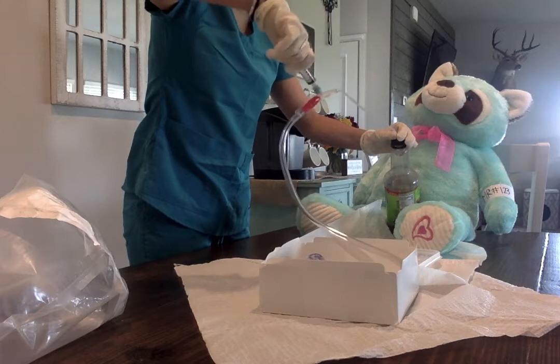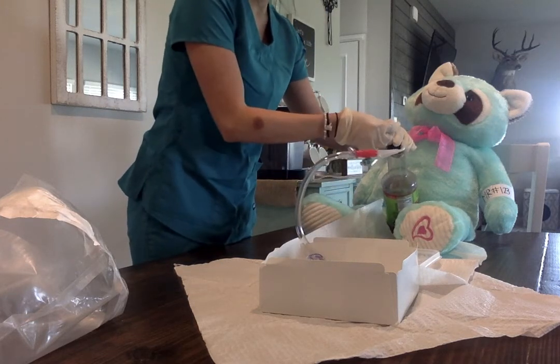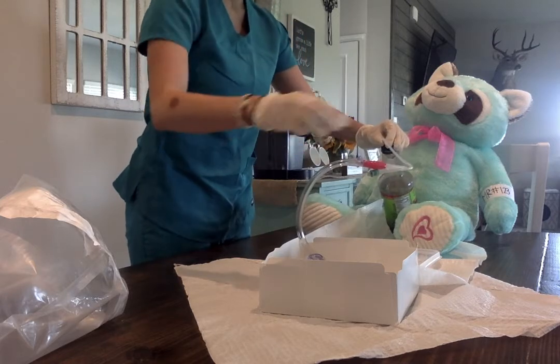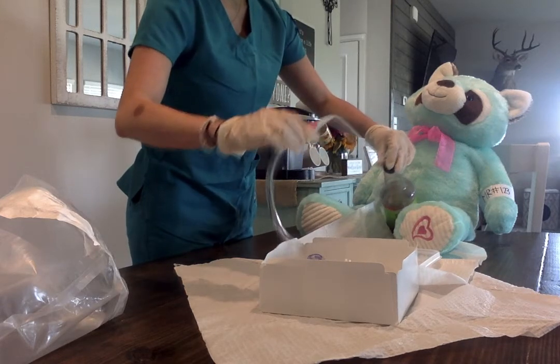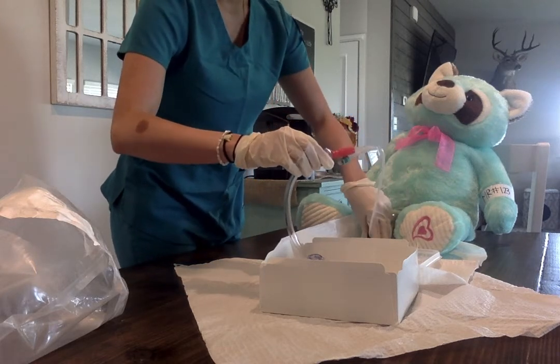Okay, so once that is done, pause that and I feel a little resistance. I'm going to lay that back down.